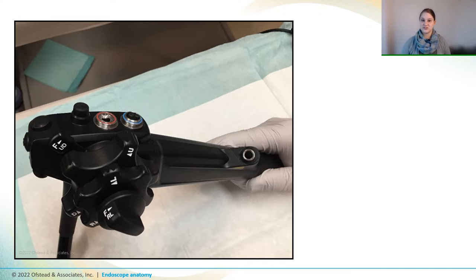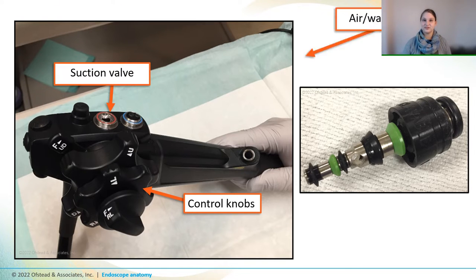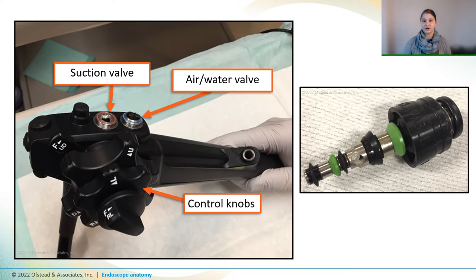So let's take a closer look at a gastroscope control handle, which has control knobs on the side that let the operator move the bending section. And those red and blue circles that you see are for the valves that control air, water, and suction. The red one is where the suction valve goes, and the blue one is where the air water valve goes. There's also an instrument port here, which is used for passing forceps and other instruments down the insertion tube and into the patient.